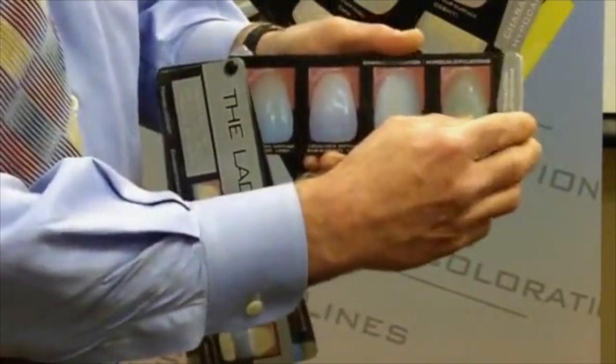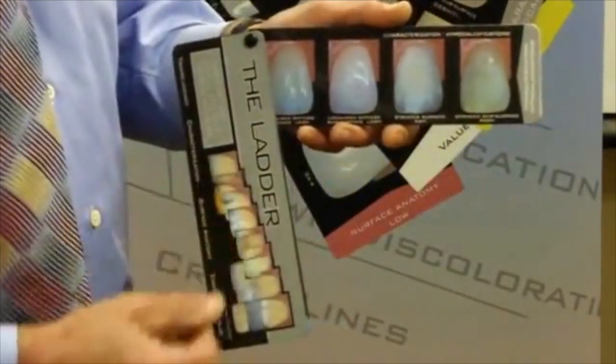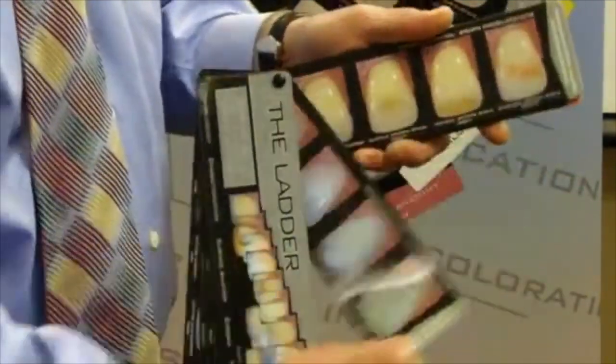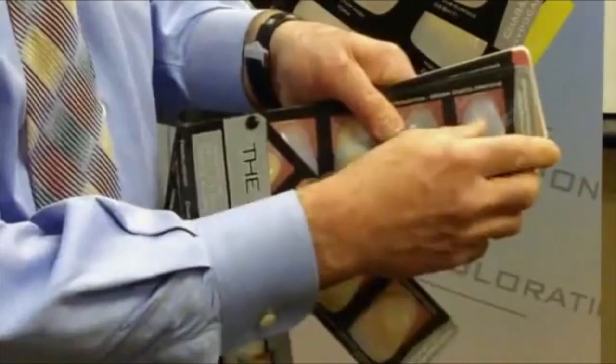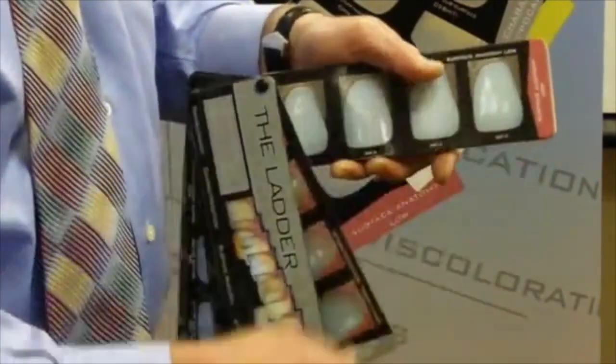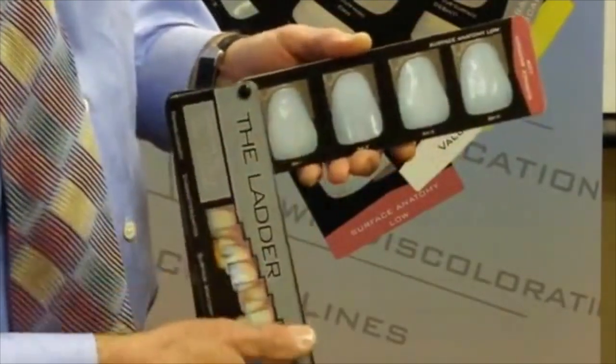I'm not going to use this for a new restoration, but maybe parts of images. Next are brown discolorations, microfractures, surface anatomy, which again is difficult to capture photographically.